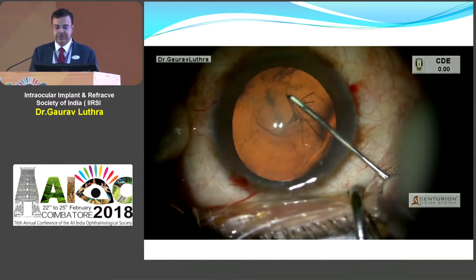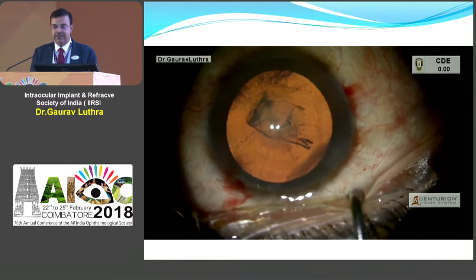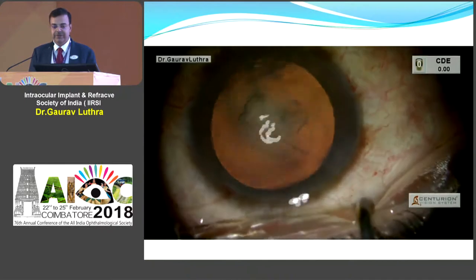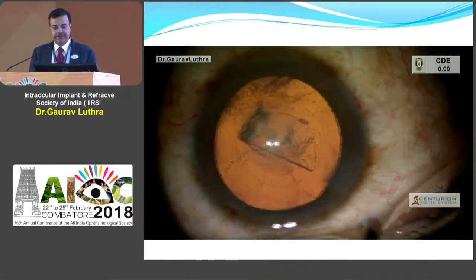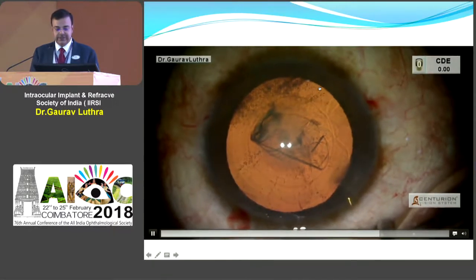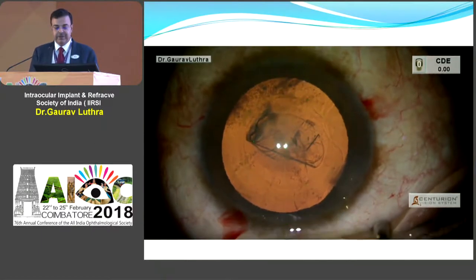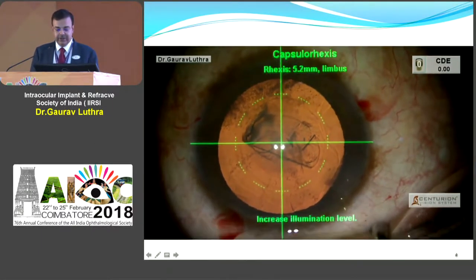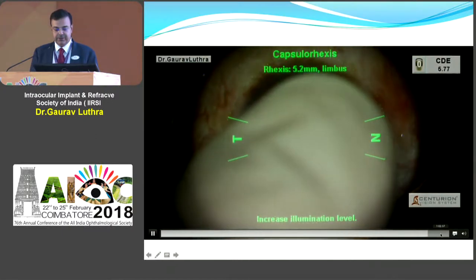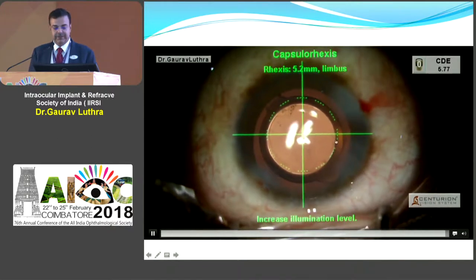Sometimes you'll have bigger corneas and smaller corneas, so you may not get an exact size estimate. If your white-to-white is small you may get a very small rhexis, and if you have a big cornea — 12.5 mm or something — you will get a bigger rhexis. The rhexis marker helps ensure you get the right size. You can see here we are checking the rhexis we made with the Verion, and it tells us we got it really well. At the end of surgery the overlap is pretty good.